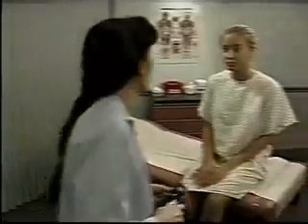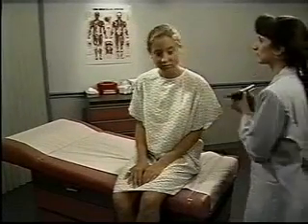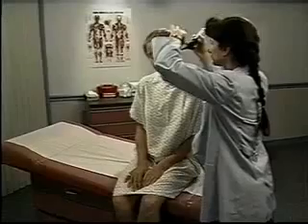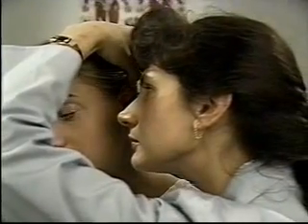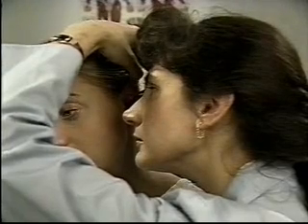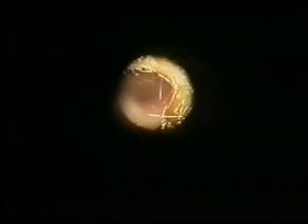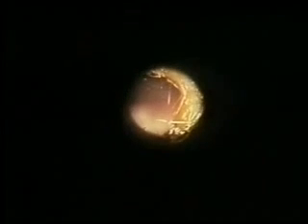To do this, select the largest speculum the patient's ear canal will accommodate. Position the patient's head so that you can see through the otoscope comfortably. Grasp the auricle firmly but gently, and in an adult, pull it up, back, and slightly out to straighten the ear canal. Then insert the speculum gently into the ear canal. Note any cerumen or earwax that may impair your view. Also observe for any discharge, foreign bodies, redness, swelling, or scaling.